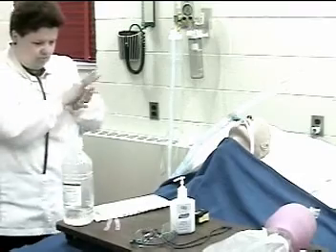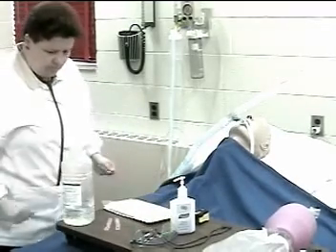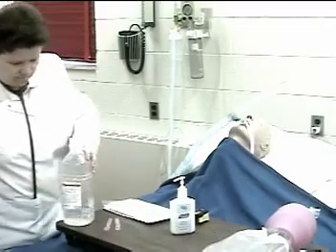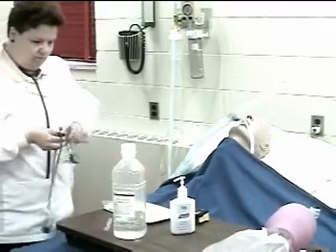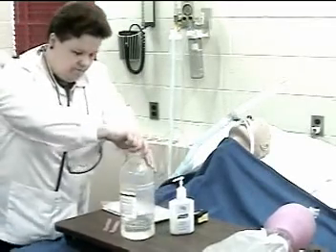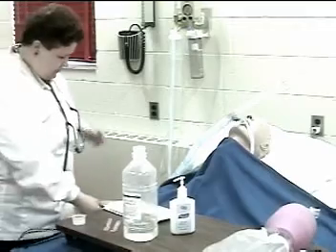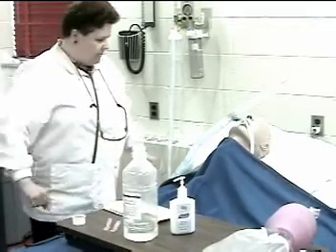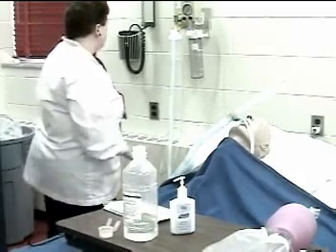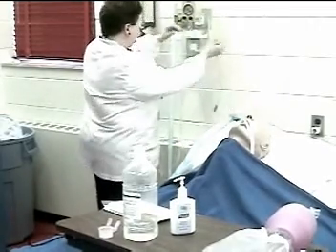Step two is obtaining required equipment. This includes a suction kit that has a sterile catheter, sterile gloves, sterile basin, sterile water, saline, eye protection, saline packets, stethoscope, and an oximeter. Water soluble lubricant may be beneficial, though most times it may not be necessary. You will also need a vacuum gauge and trap — set that between negative 80 and negative 120.